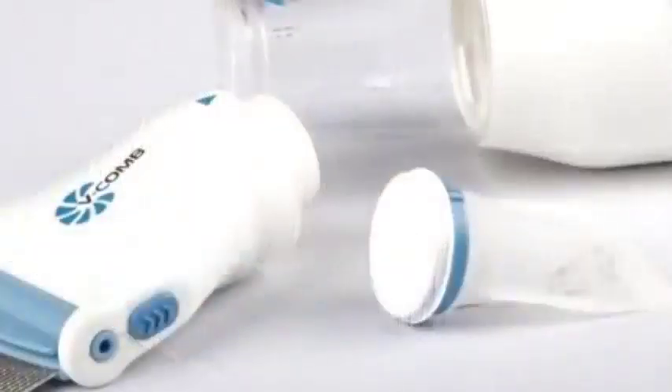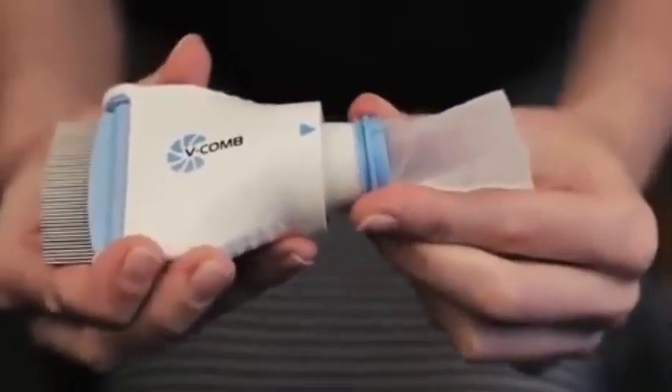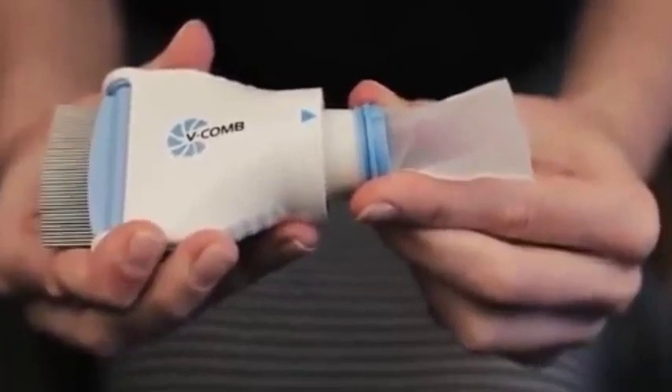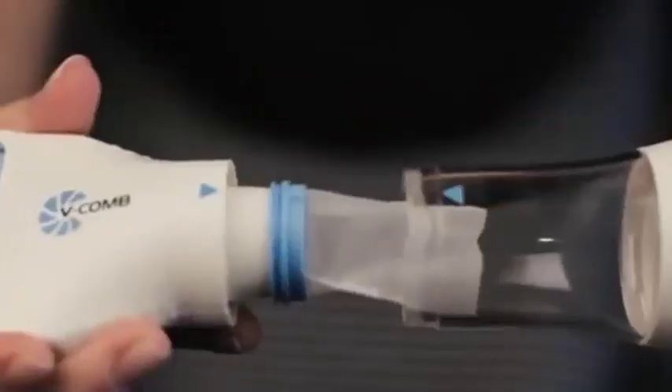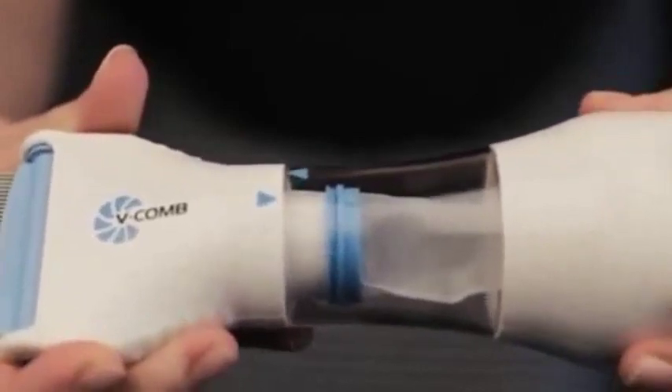Using the V-Comb is easy. Securely attach the capture filter to the V-Comb combing head, ensuring that it clicks into place. Reattach the combing head to the main body by aligning the guiding arrows and twisting to lock.